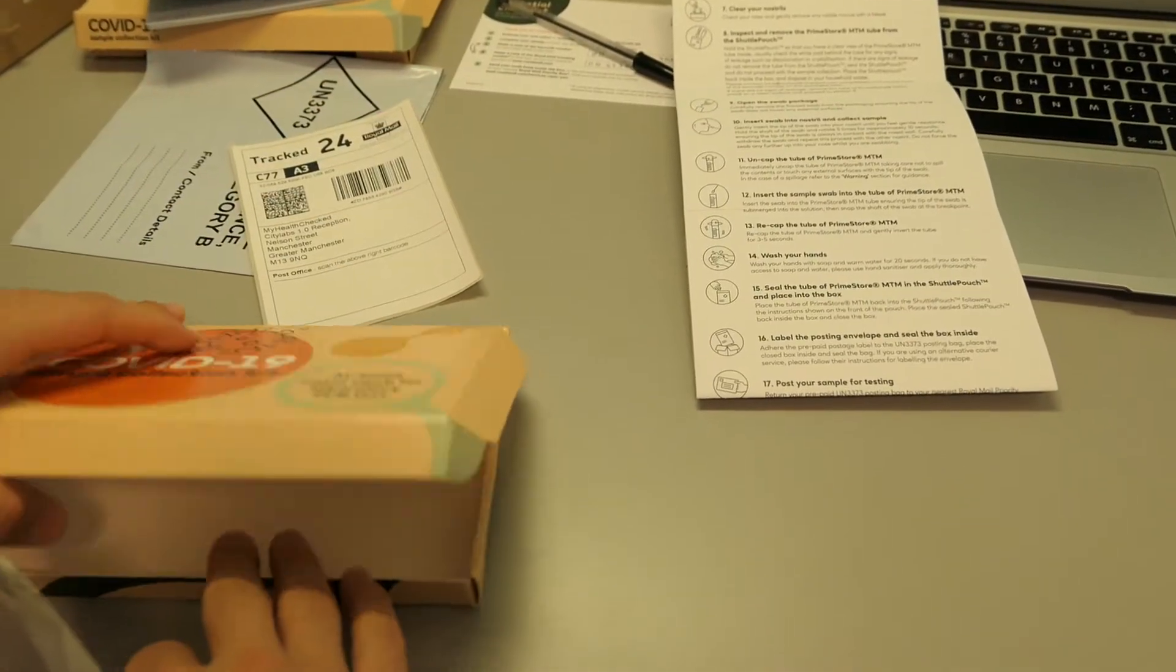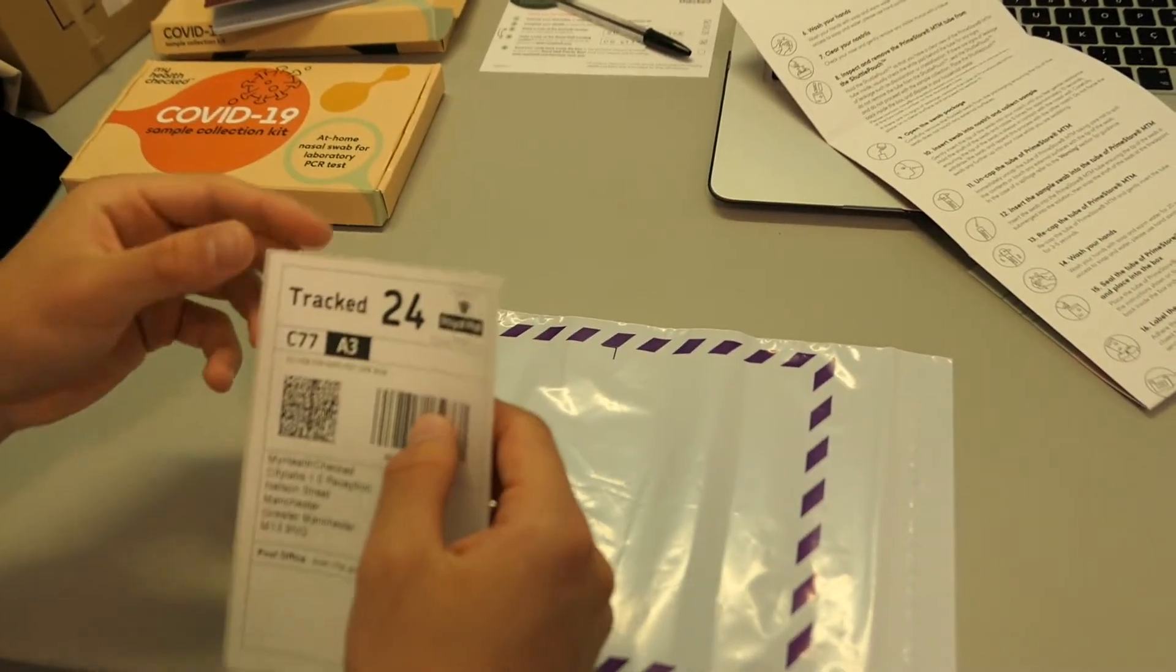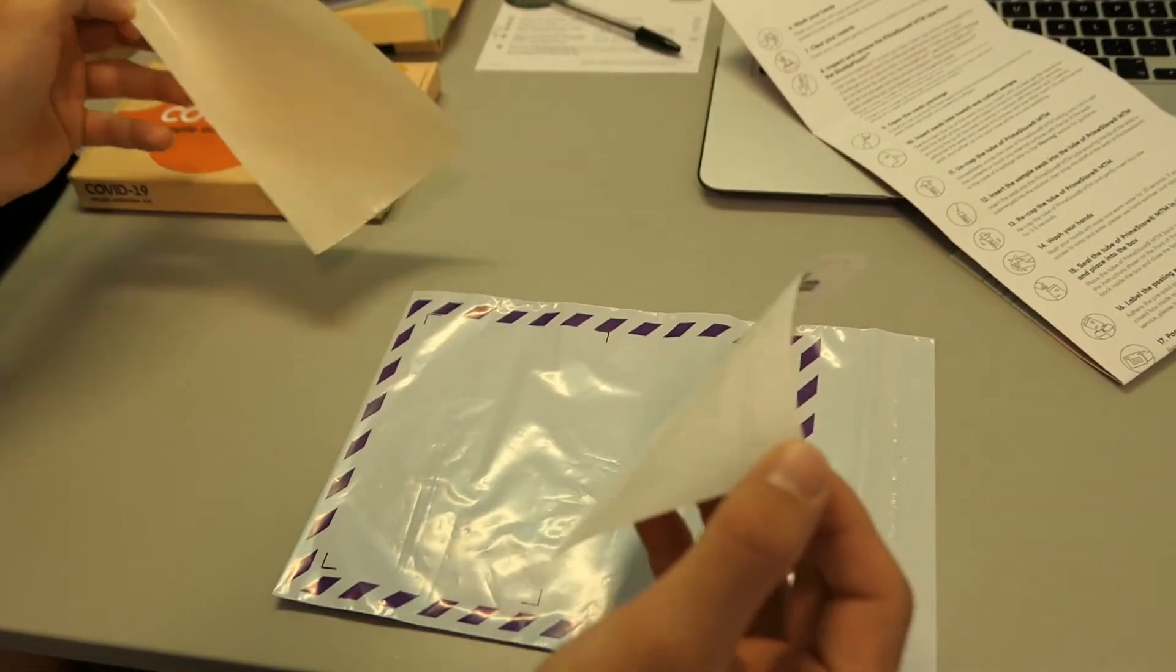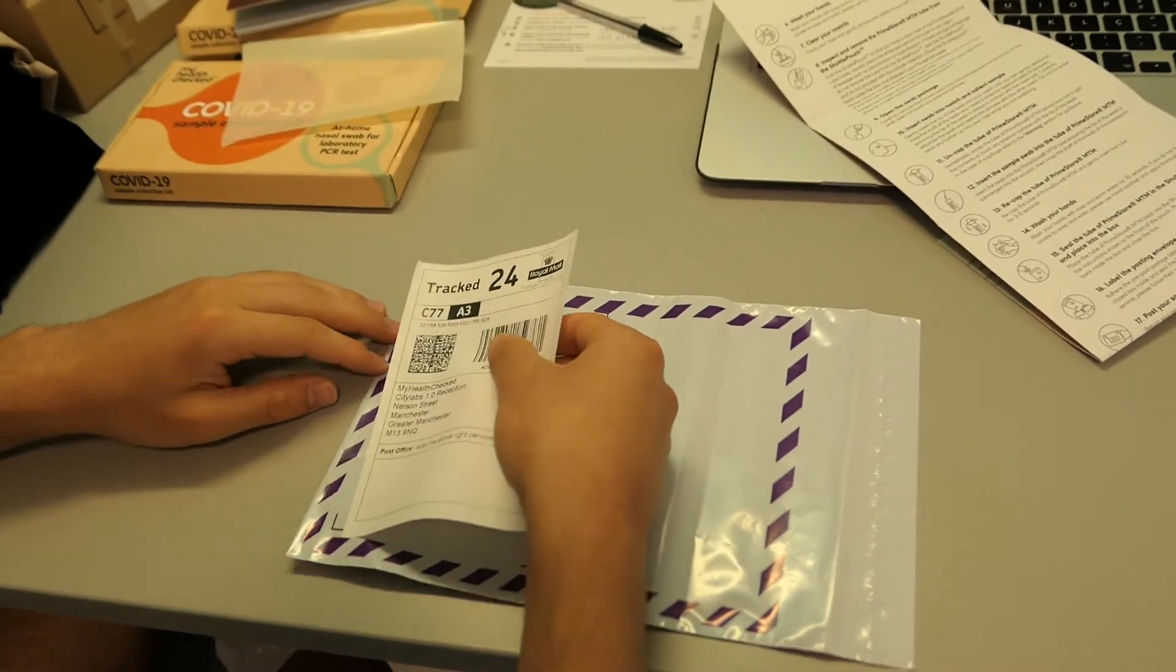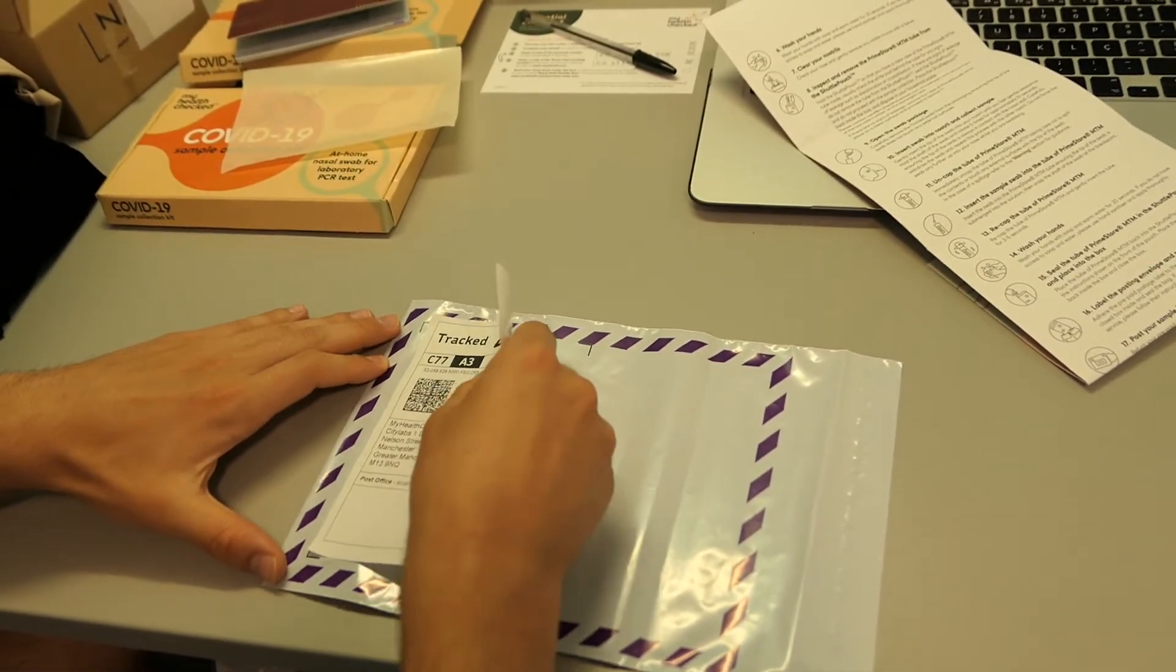Place the sealed shuttle pouch back inside the box and close it. Adhere the prepaid postage label to the UN-3373 posting bag. Place the closed box inside and seal the bag.